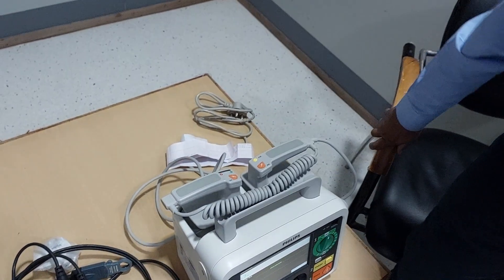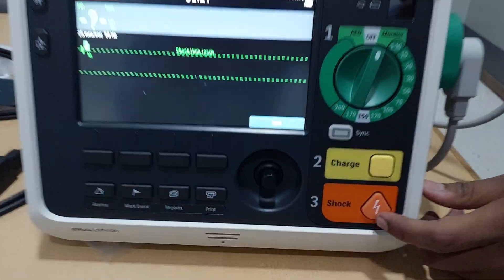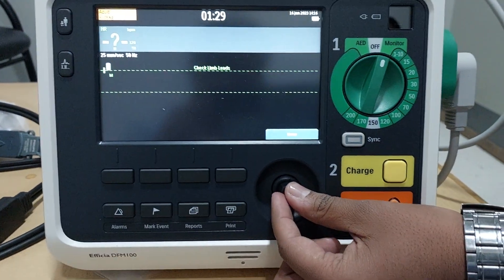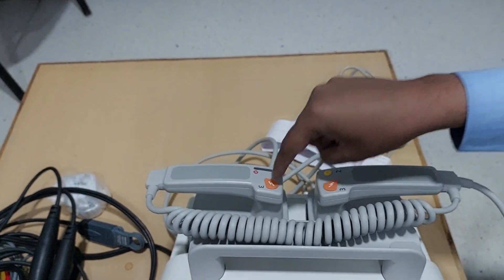These are some basic controls on the defibrillator. This is the charging switch. This is the shock switch. These are the different parameter control switches. You can also discharge from here — these are the discharging switches.